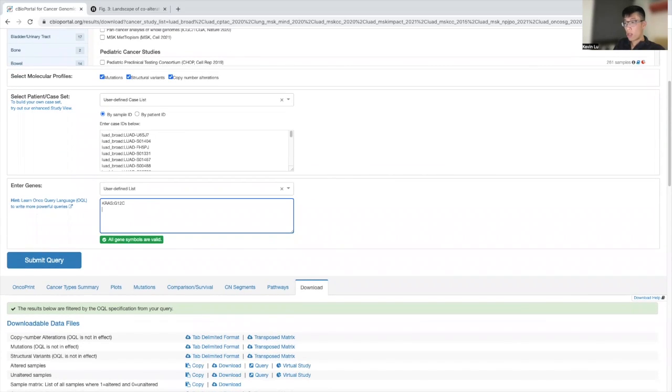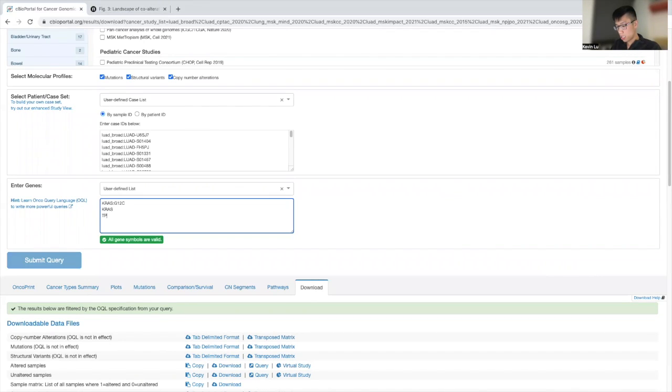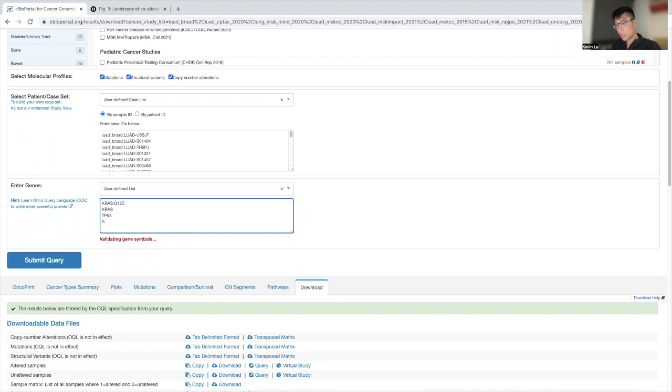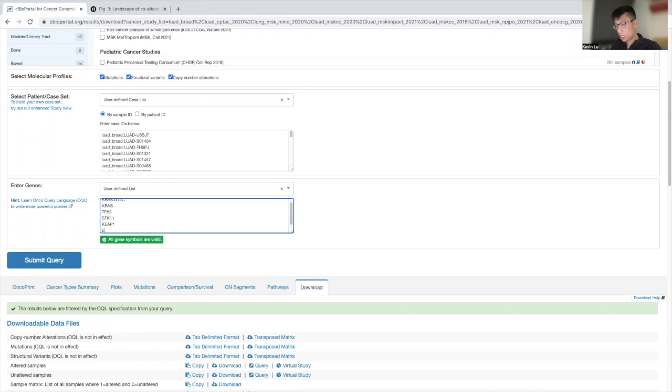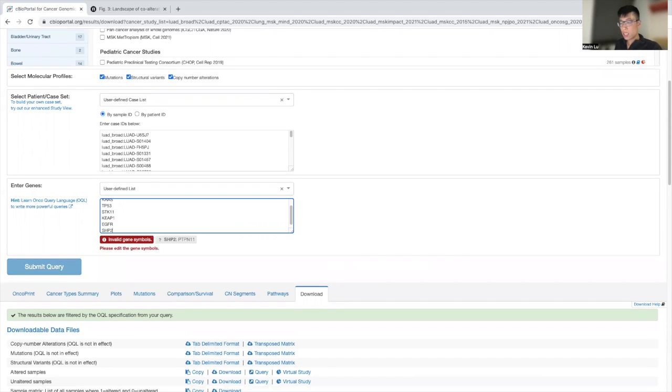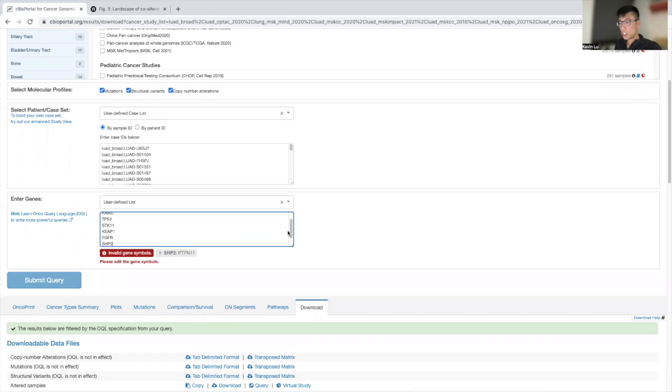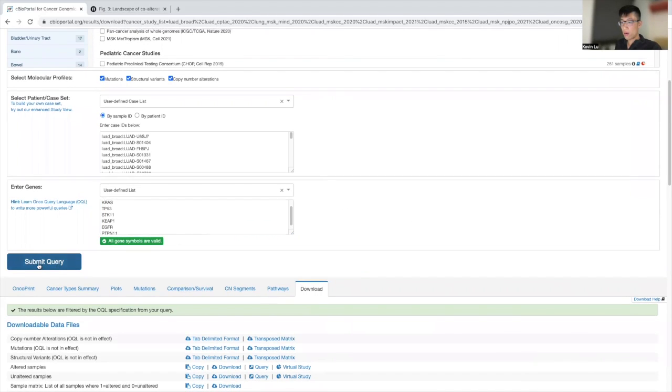And so now we can take a look and enter the co-alterations that we want to also have on the figure. So I'm just going to include the first couple. And typically I just have a document that I include with all the genes that I want to include, so I can just copy and paste versus having to manually insert each gene. And we're going to submit query.